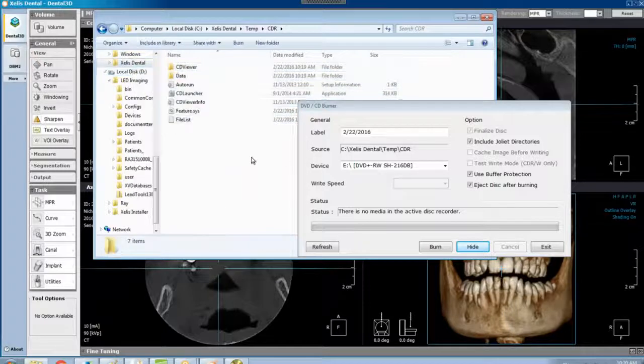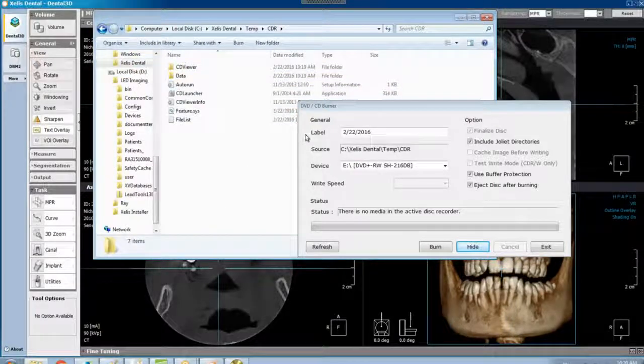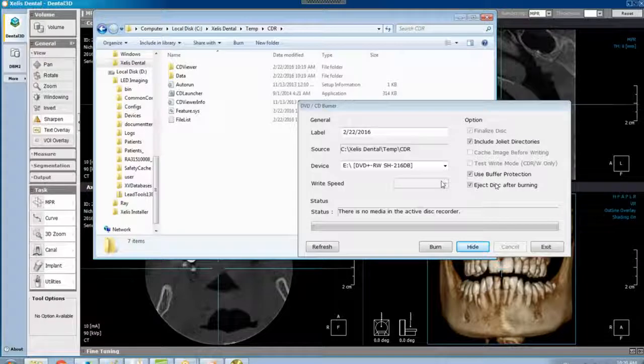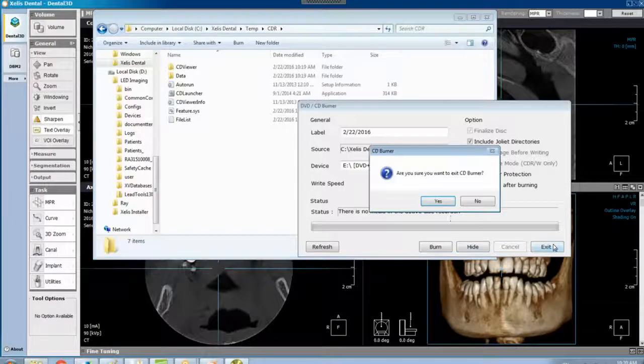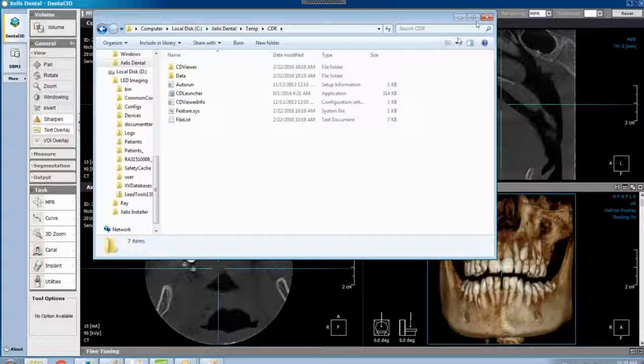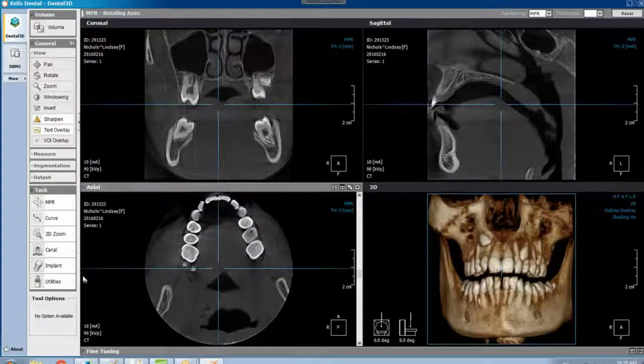So that's how you copy a CT scan to a flash drive. It's utilities, DVD burn, and then copy, paste to the flash drive.